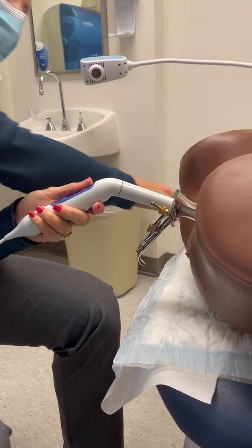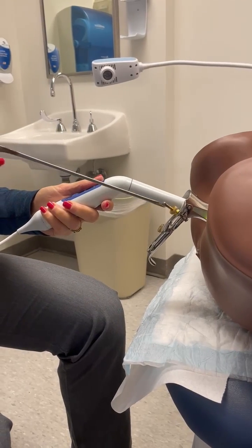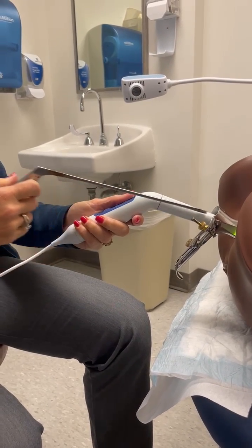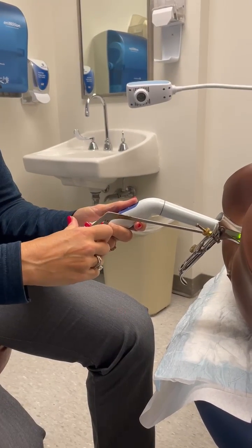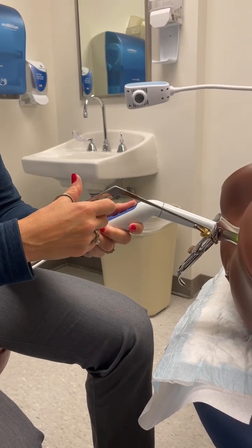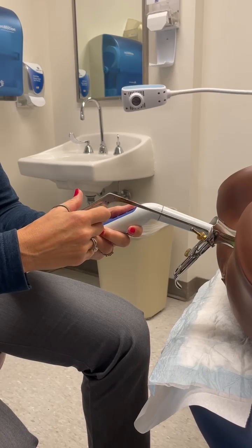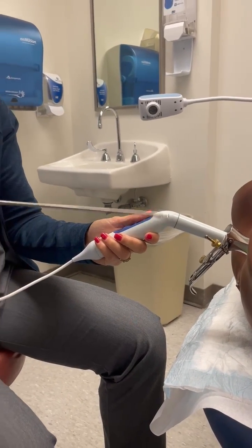At that point I switch from my dominant hand to my less dominant hand so I can do the biopsy with my right hand, as I'm right-handed. Because the device sits about two centimeters from the cervix, you're able to introduce the biopsy forceps alongside it and get a biopsy at any point on the cervix without being disrupted by the presence of the colposcope. You can take the biopsy either through direct visualization or by looking at the image on the tablet.